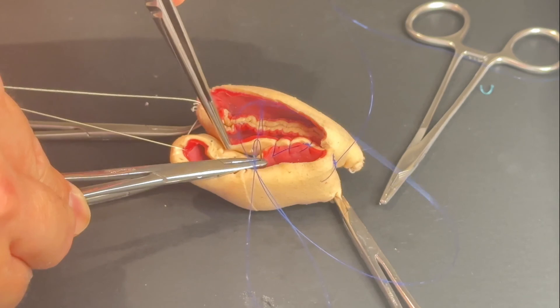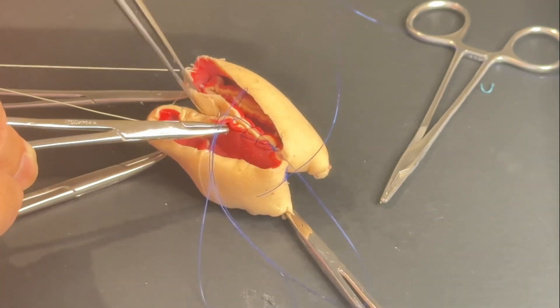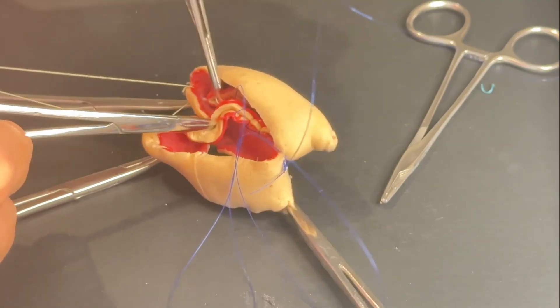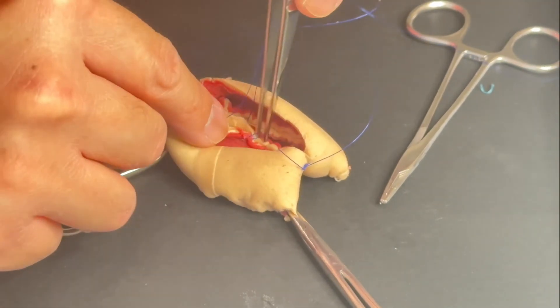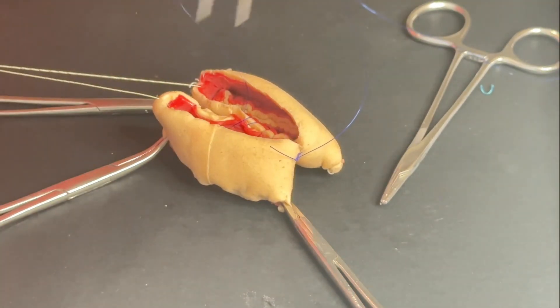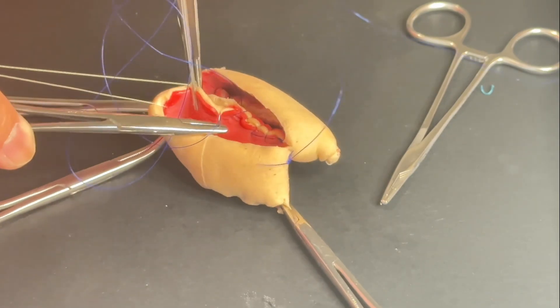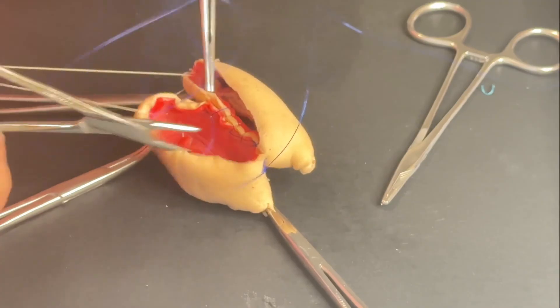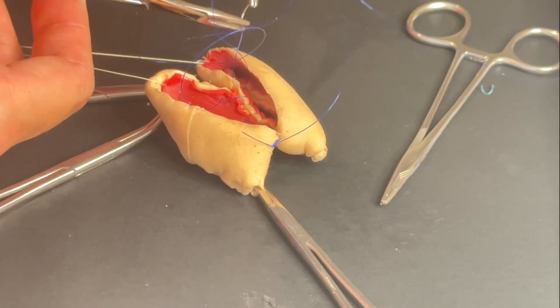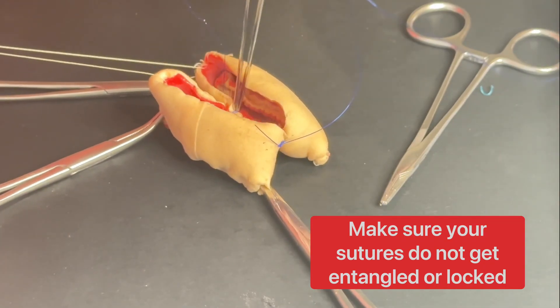Moving along, I have to guide this to avoid it bunching up. That's why it's super important to have somebody who is a good assist whenever you're doing this — someone who will be moving the suture out of your field and maintaining the tension.